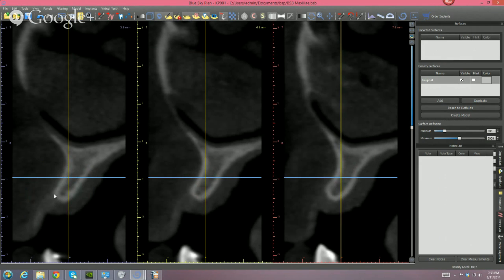Maybe I'd put a graft over here, but sometimes you need to say no. And this is a case that I would say 90% of all guide labs would do. Doesn't mean you shouldn't do it, just means I'm a little uncomfortable. And I think not only does the histology play a role here, but I think you can actually see the histology issue right over here in terms of the available bone that was left. I didn't see any cancellous bone over here, only cortical bone with a limited blood supply. So I just wanted to make that point.